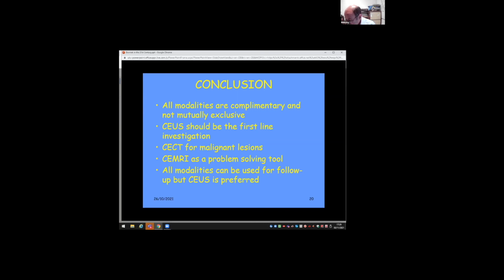The rest of them, CT and ultrasound agreed with each other on all the rest, except 11 cases. Now, in those 11 cases, 2 were downgraded by ultrasound. I showed you a couple. And 5 were upgraded by ultrasound. That fits in with what I told you earlier, which is that because ultrasound and MRI are much more sensitive to septa, you tend to upgrade rather than downgrade. So we just fitted in with the rest of the CEUS community.